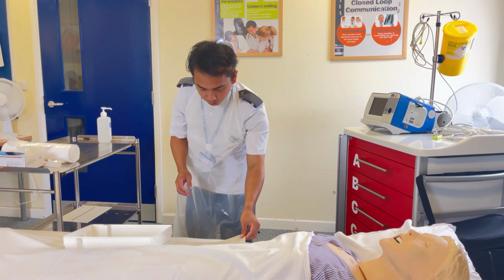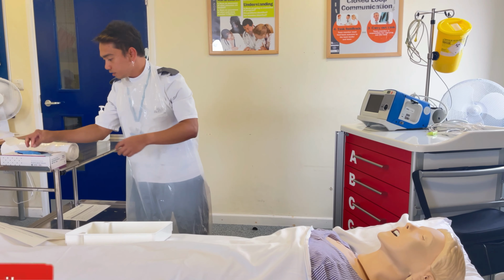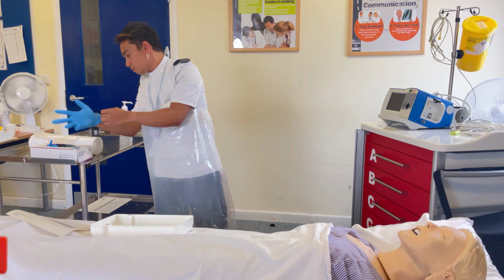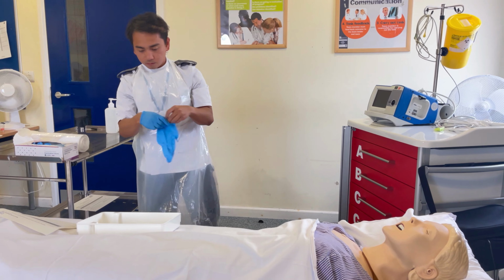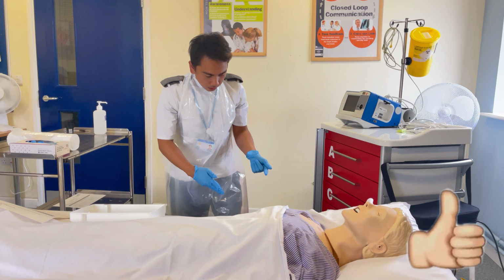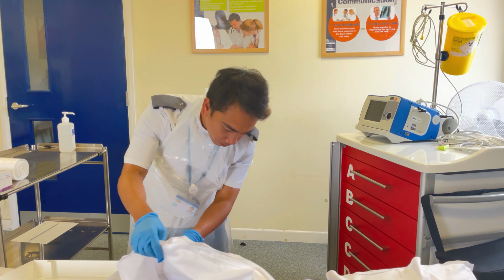Okay. So I'm just going to wear these gloves, which are from a dry, intact, in-date box. All right, so I'll just be exposing the area.